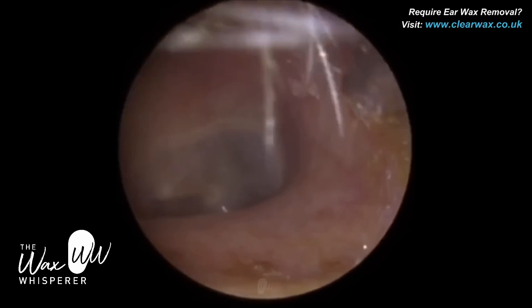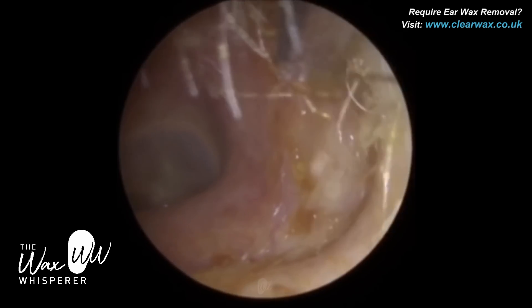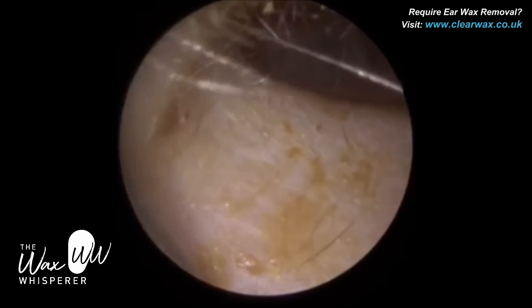I'm just mopping up near the entrance using a fine-gauge probe. Lovely healthy ear canal and eardrum. And just mopping up just at the entrance there.